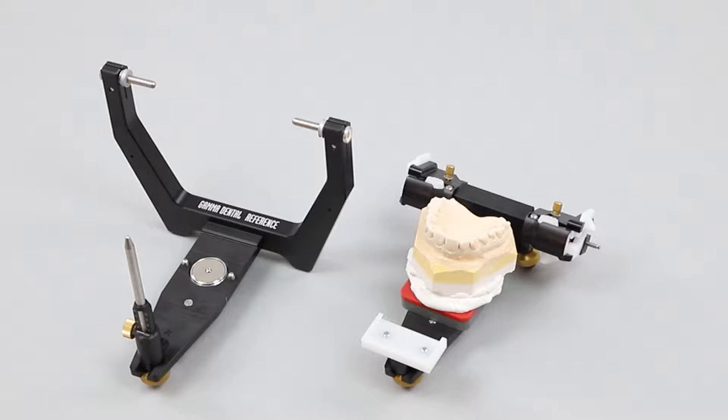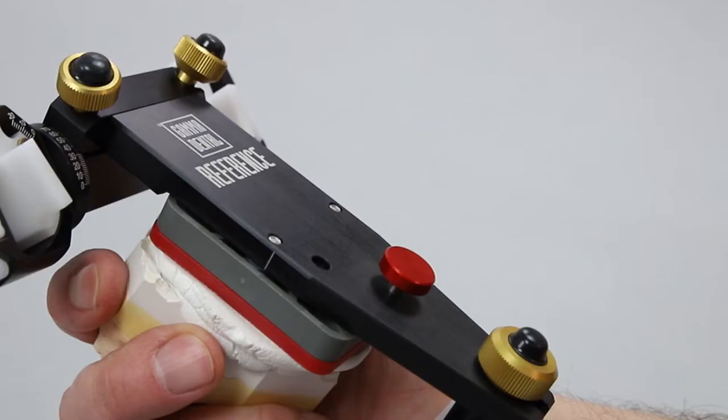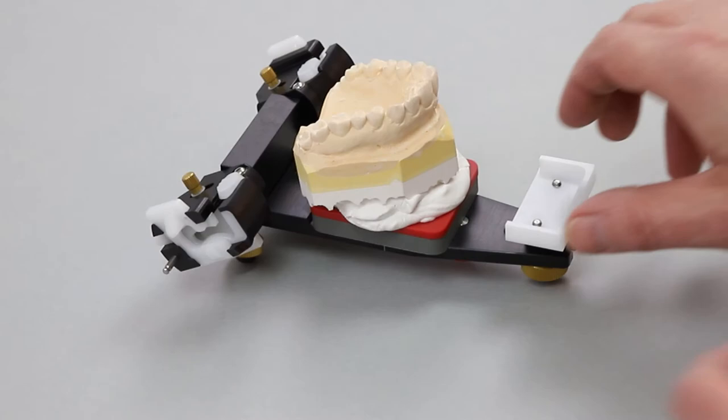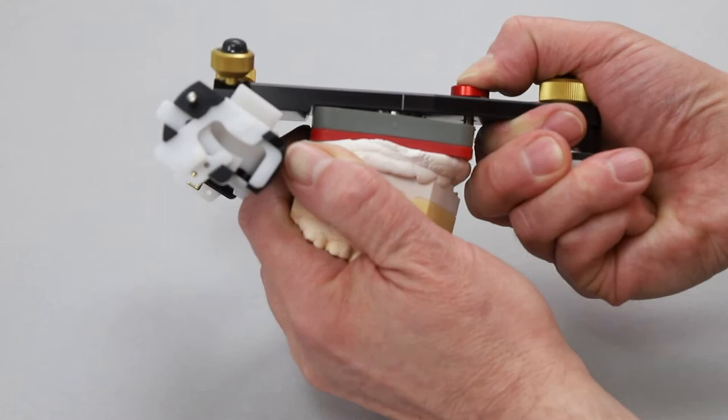This is the upper member holding the maxillary cast, and here we can see the lower member for holding the mandibular cast. On the outer side of the articulator there are two red ejector pins for correct and comfortable takeout of the articulated models.